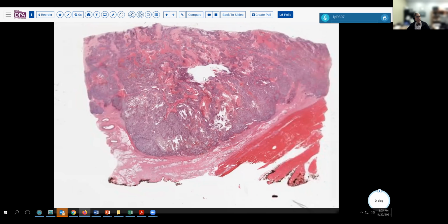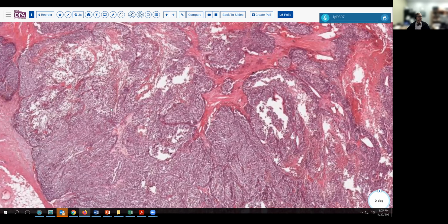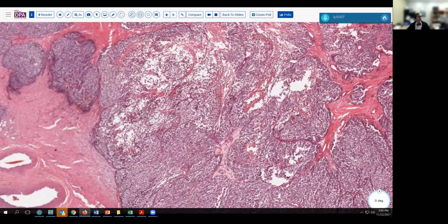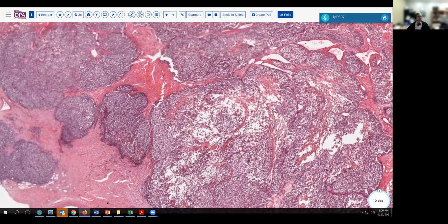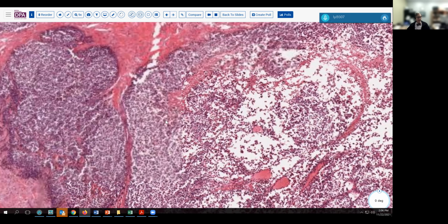Okay, well, we'll finish up here with one additional sarcoma without a particular pairing, but with some of the same caveats. Looking at this tumor, we notice how nested it is. And so oftentimes we think nested tumor, epithelial type morphology. This is fairly blue. It's got this nested pattern, a little bit of clearing, falling apart sort of appearance, fairly uniform cells here.